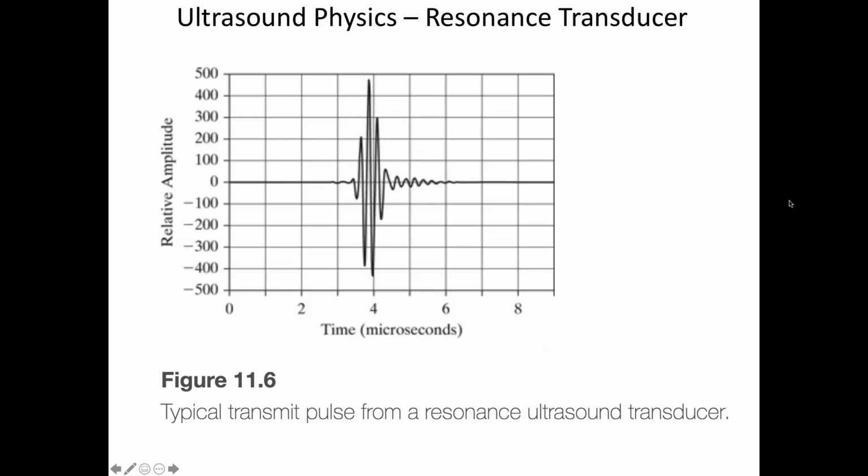You would imagine that when the focused ultrasound device is causing a large amplitude vibration in a 1 centimeter sphere or something like that, that would show up on the other ultrasound device as something, right? Whether or not it would be, if you image, say, outside the frequency range of the therapeutic device, such that it was just a change in the impedance at, say, the diagnostic frequency.